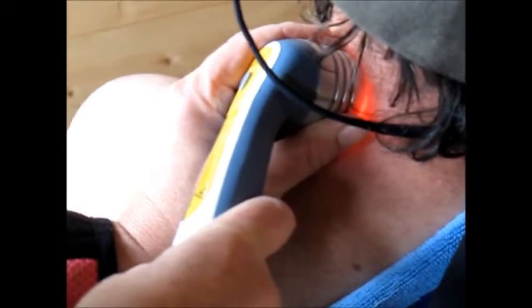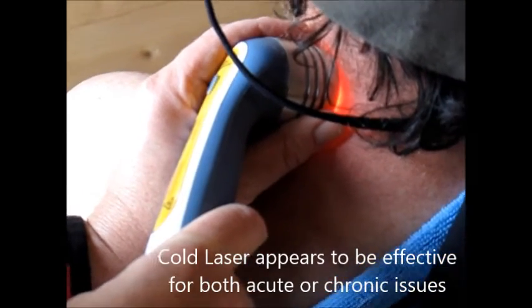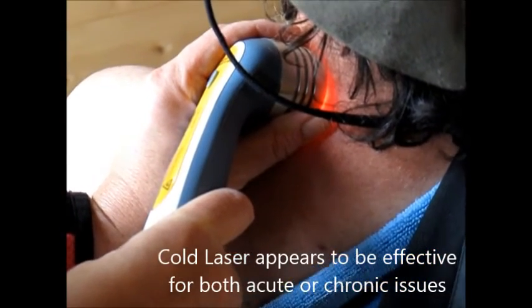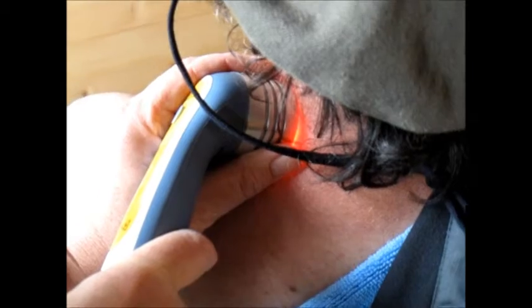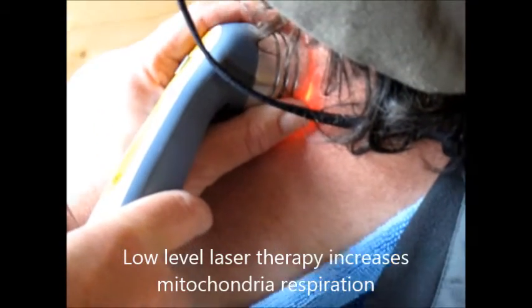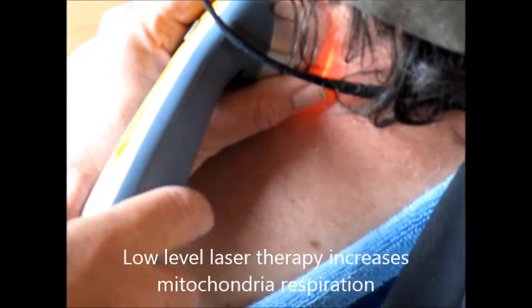This goes pretty deep. The theory behind laser is it can really pretty much treat chronic, acute, anything. Science is now proving that it's the mitochondria that are being affected. There's an increased respiration of the mitochondria, which — well, we all know we need more of that apparently.